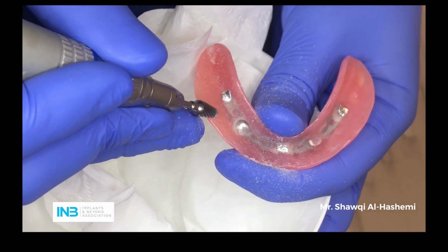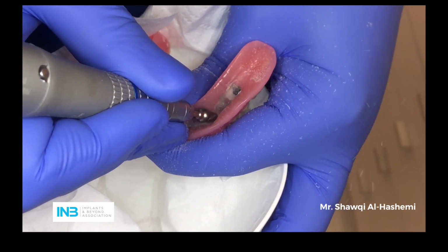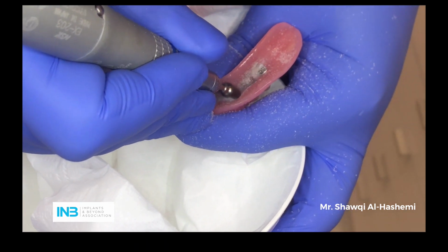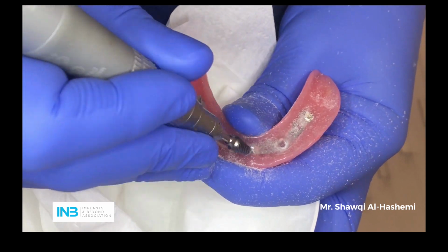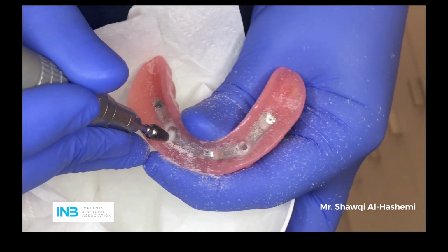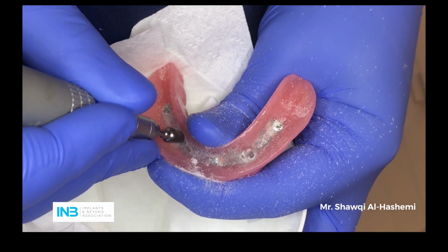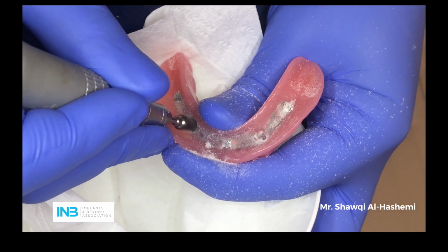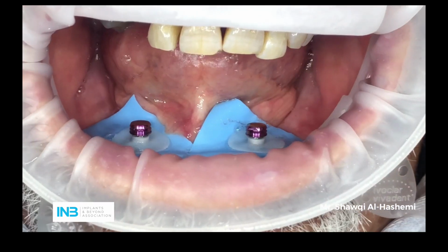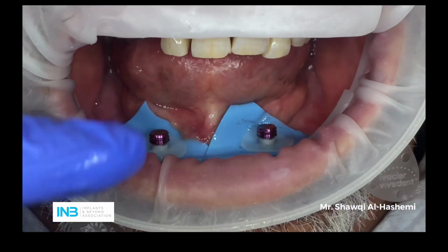So approximately 3 millimeter depth. There we go. And you can see this denture is reinforced, which is really good. You've got to have a really strong denture, not just any denture, otherwise it'll end up breaking. Okay. Now, right, so we made the housing holes there for the locators.